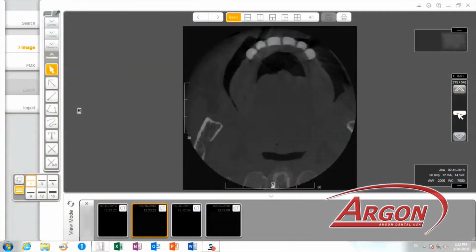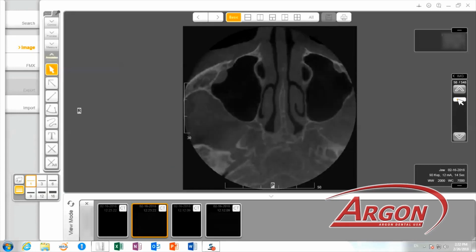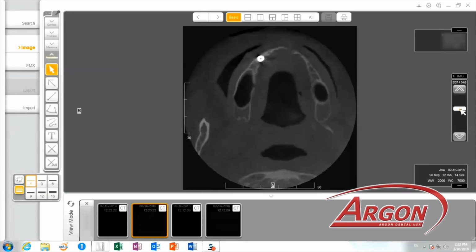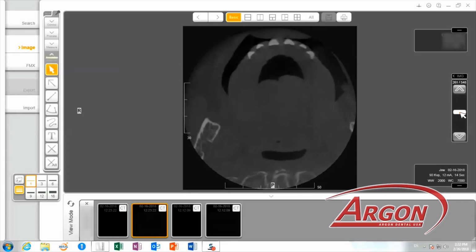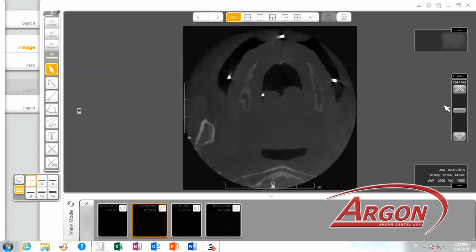Now you can see the post-op CT scan with the denture in the patient's mouth. Notice the white dots, which again are the SureMark markers. Now we were able to take the CT scan with the denture out of the patient's mouth and merge it with the CT scan of the denture in the patient's mouth.